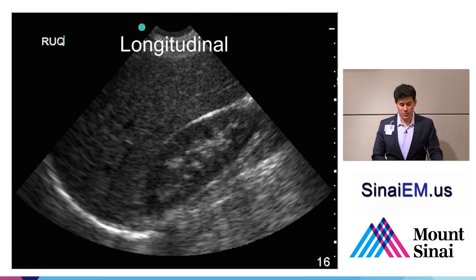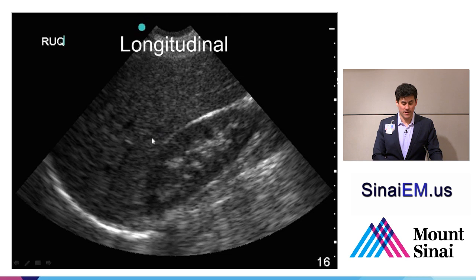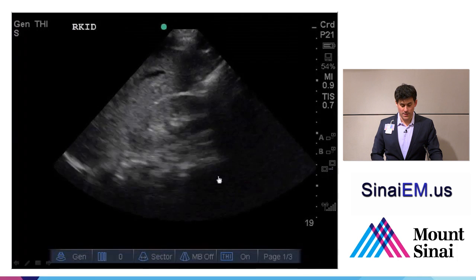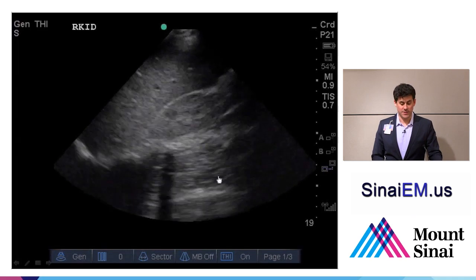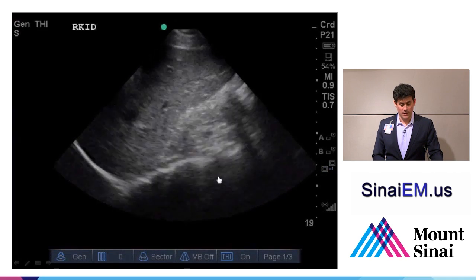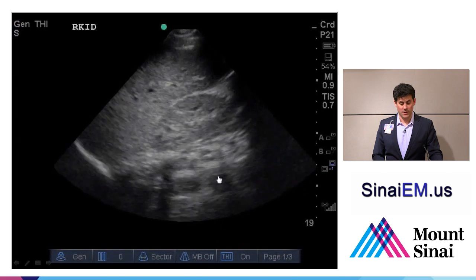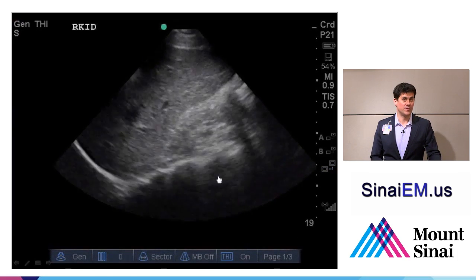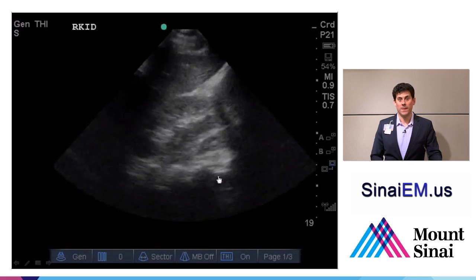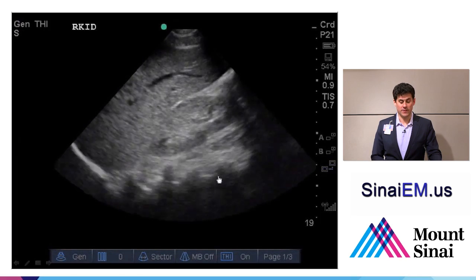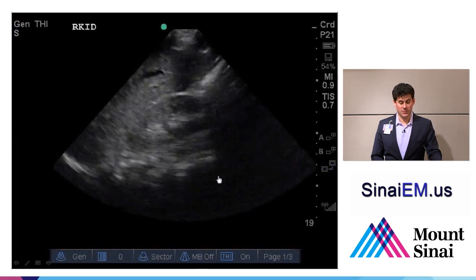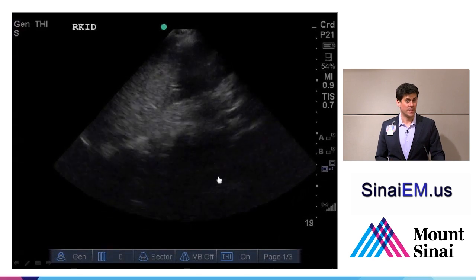In a longitudinal orientation, similar to a FAST examination assessing the right upper quadrant, we'll see the liver, diaphragm, and a longitudinal view of the kidney behind the liver. Here's an example of fanning anterior to posterior and superior to inferior — the sonographer is getting a full view of the kidney including the superior pole, inferior pole, posterior, and anterior. This gives a good sense of the entire kidney structure so we don't miss hydronephrosis.